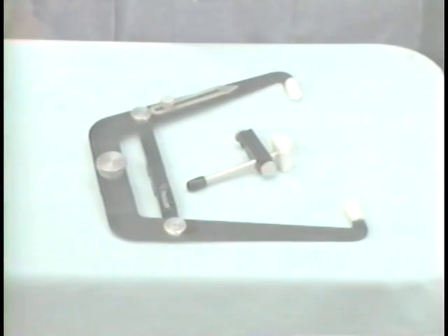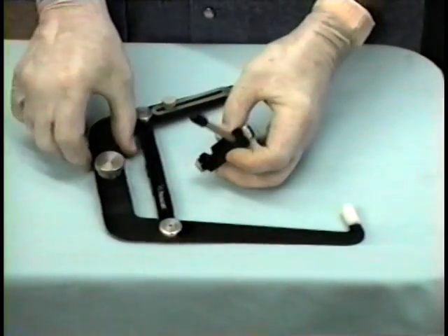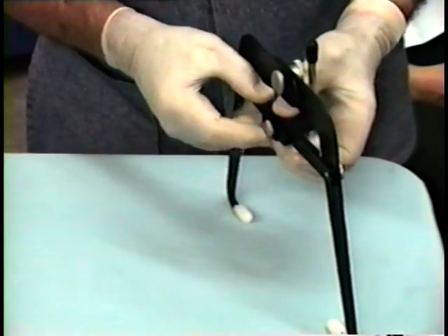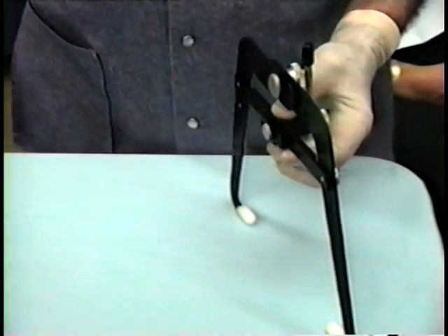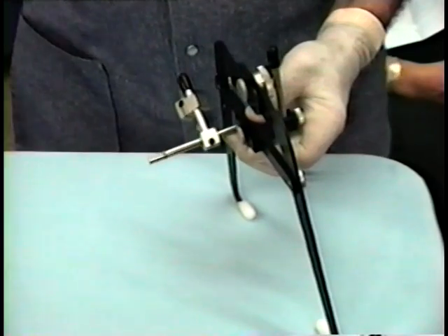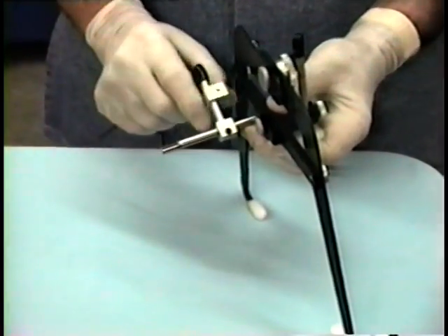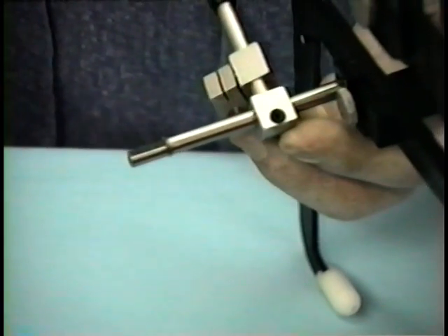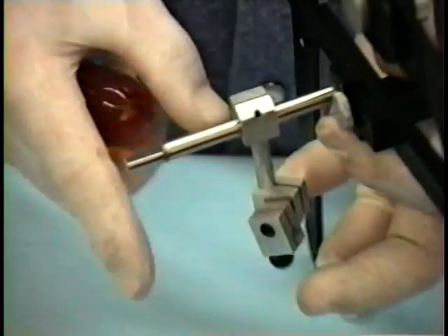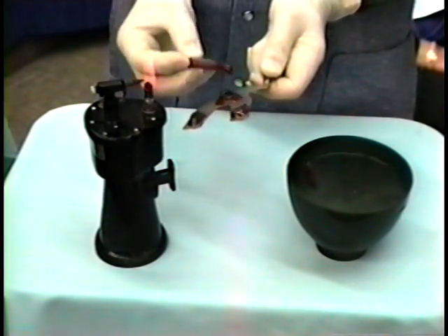The arbitrary axis facebow transfer procedures. Lock nasion relator to crossbar of facebow with thumb screw. Insert and lock bite fork attachment posts to crossbar of facebow. Make sure double toggle clamp is loose with hex wrench. Loosen single toggle clamp with hex wrench. Compound and tripod arrangement on both sides of warm, dry bite fork.